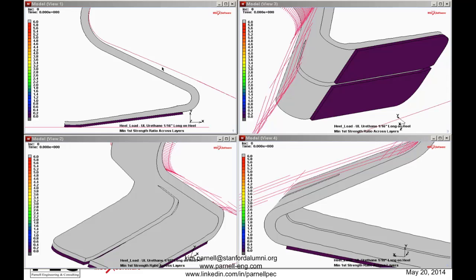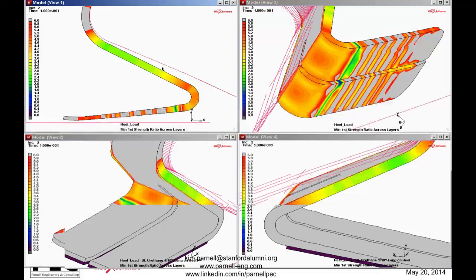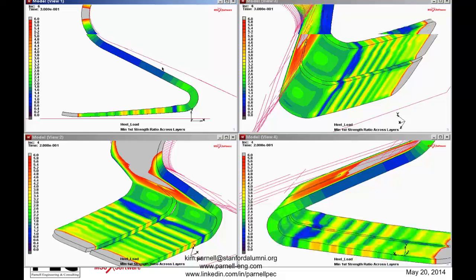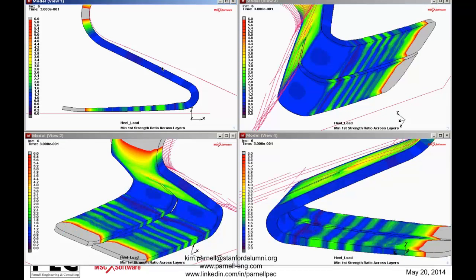So I'm plotting the minimum first strength ratio across all layers. That means that you look at a particular element and integration point, and then where there are multiple layers specified for that element, look across all layers at that location, find the lowest value, and display it. So it's a quick way, where you have a multi-layer shell element specified, to get an assessment of the worst case at each particular location.